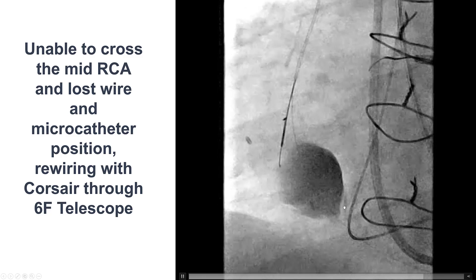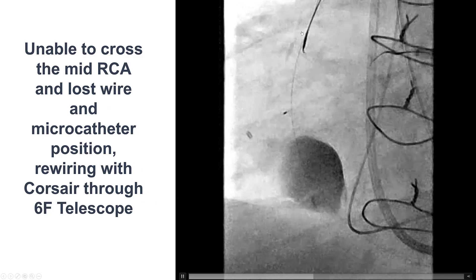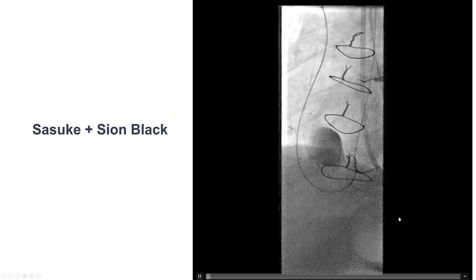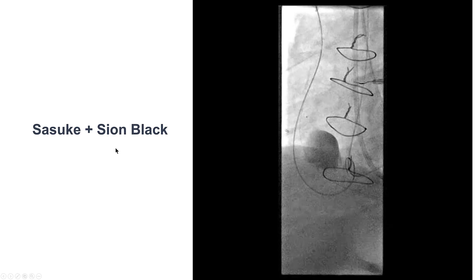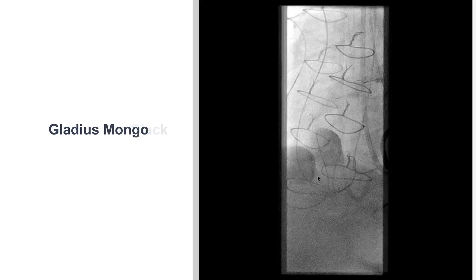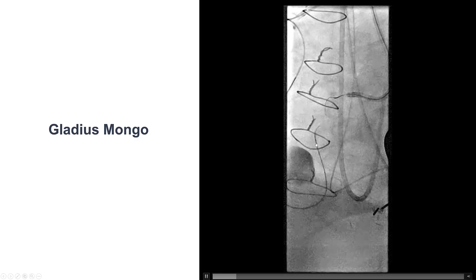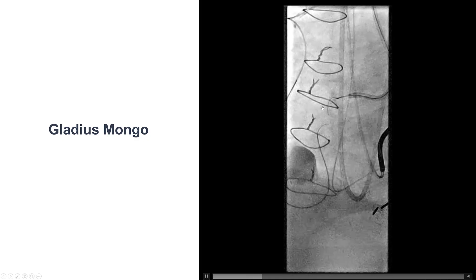We did have difficulty advancing equipment, and we eventually lost everything. So we had to start again, re-engaging the vein graft and then advancing guide wires retrograde. Once again, dual microcatheter, dual-lumen microcatheter along with a Sion Black. And then again, now we have the microcatheter to the mid-right coronary artery, and we're trying to make the two wires, the antegrade and the retrograde, get into the same spot.